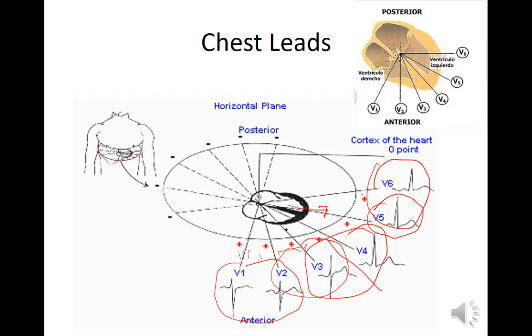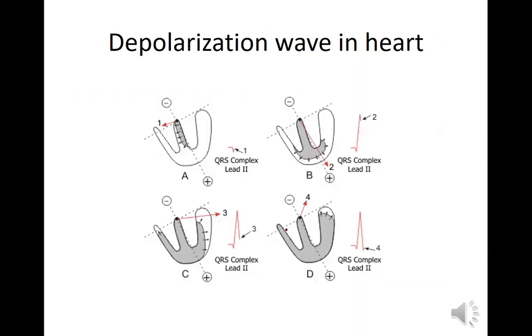So you can find out if anything is happening as far as depolarization, because if you don't have depolarization, it means something is wrong. And you're not going to have a good systole. Yeah. For chest leads, can artifacts happen too? Sure. Yeah, I think that's a good question to think about. Think about what that means.